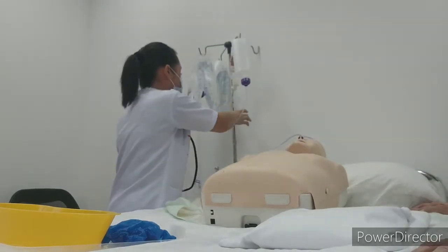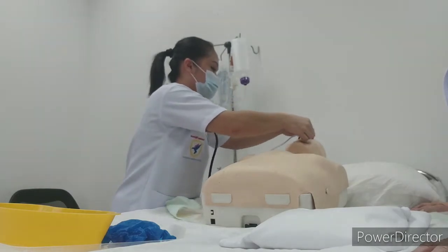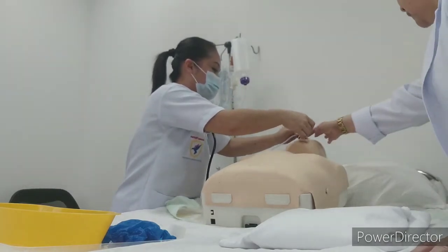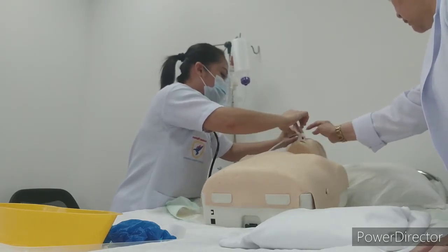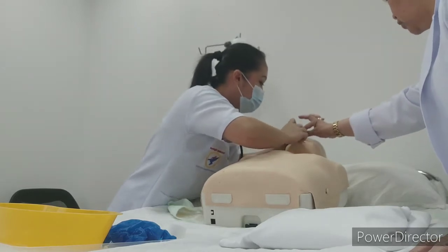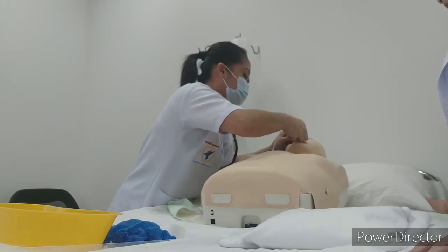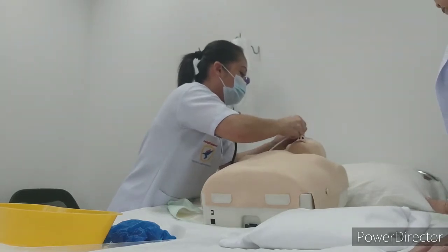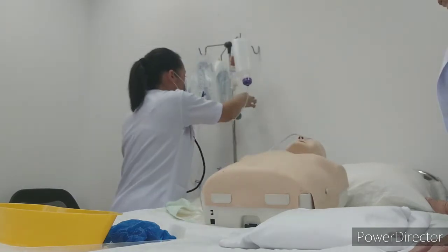Then the second one, this one, where we cut for the nasal bridge. Do like this, and don't cover here. Move down. Then crisscross. Wherever you cut up to, put it there. So crisscross. Then the other one, the last one at the top.